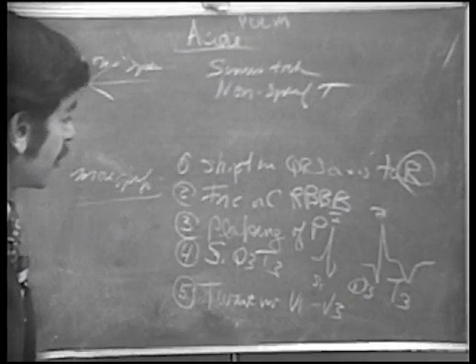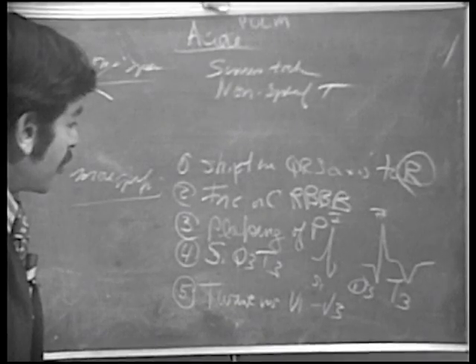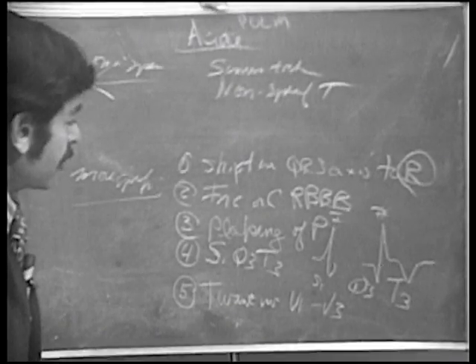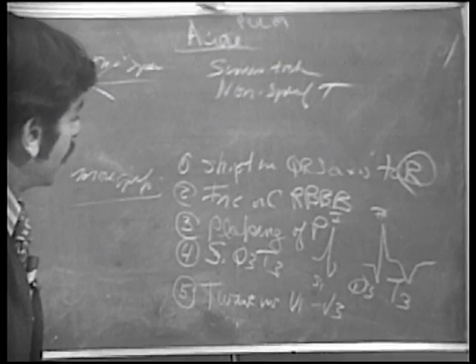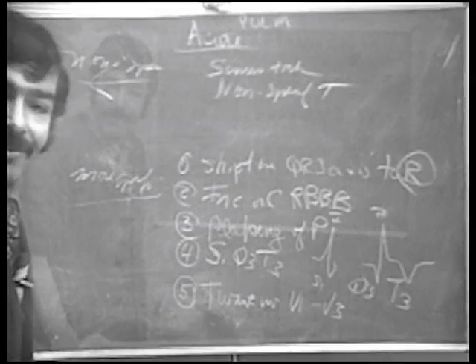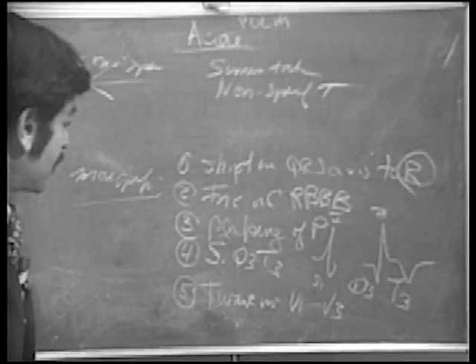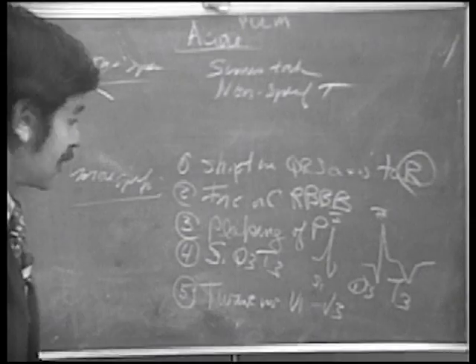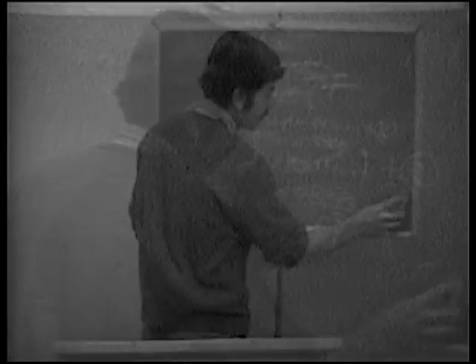Okay, well, these are then some of the criteria, or some of the things that you might look for in a patient that you're considering as having an acute pulmonary problem. There's one more, but unfortunately I just can't think of it at this point. Well, let's move on.